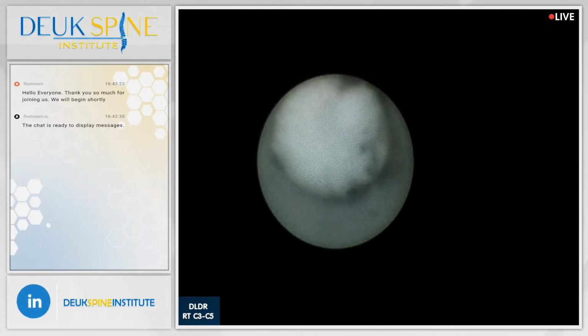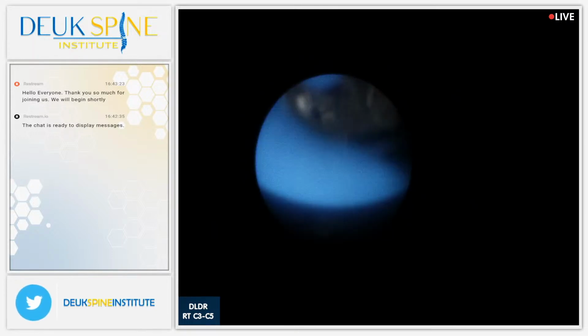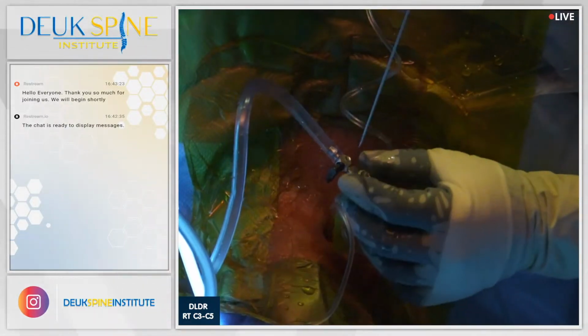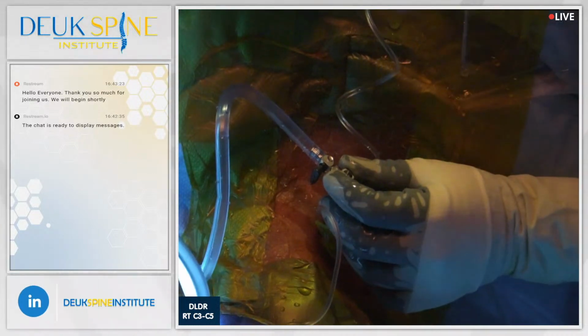We talked about this before. There's another piece of herniation right there. There's just so many. So will this disc reseal with all this damage? That's the real question. Nobody knows the answer to that, but I think it will. I can't prove that it will. Time will tell.